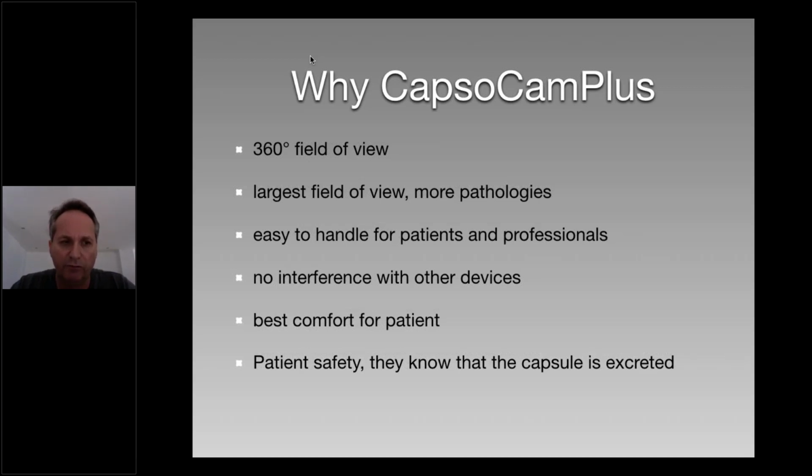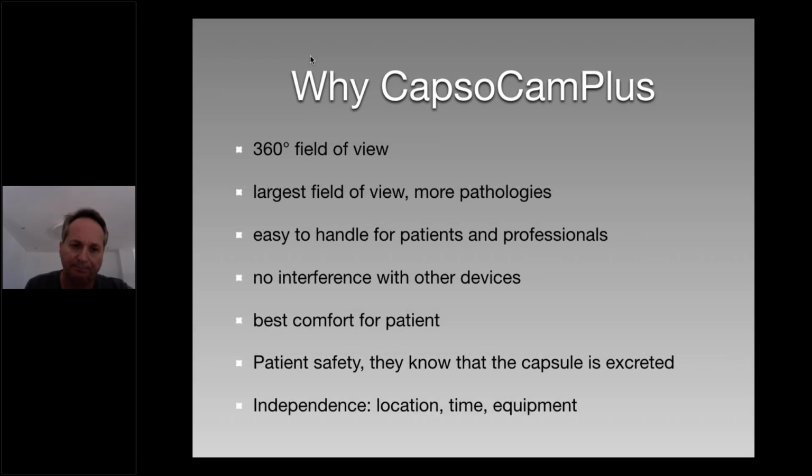So you have to perform an X-ray to say, yes, it's still in. With this system, you're 100% sure if you get the capsule back. And you're totally independent. You can do 20, 50 capsules a day if you want, because you don't need any more equipment to start the examination.